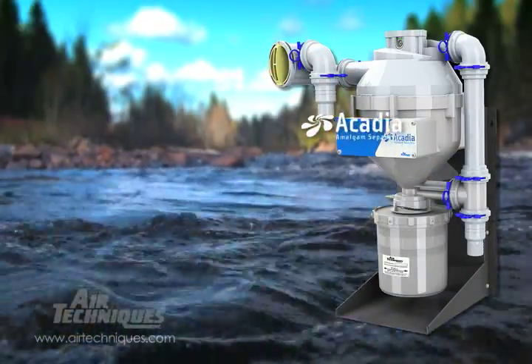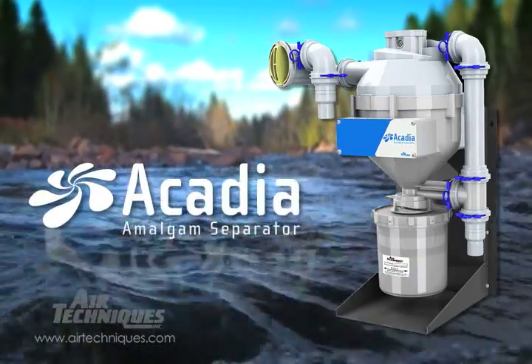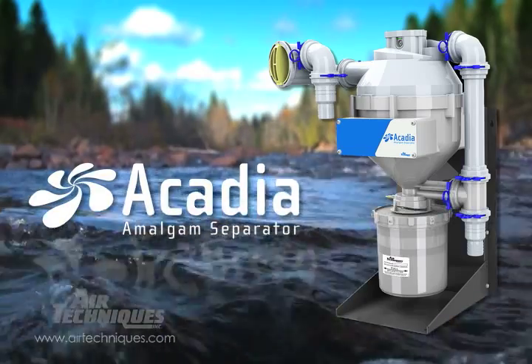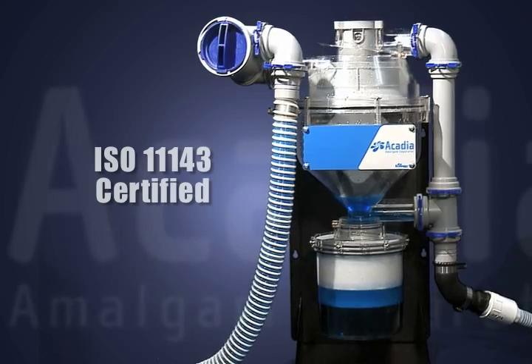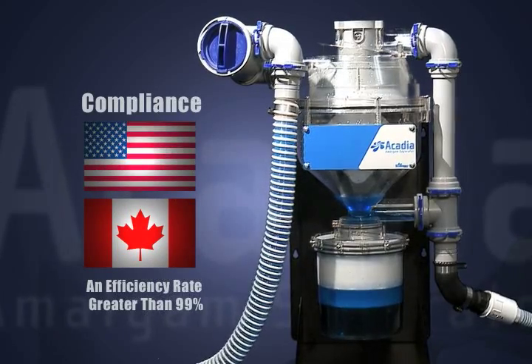Air Techniques has been powering dental practices for nearly five decades. We understand how to create an amalgam separator that works in line with your evacuation system. The Acadia Amalgam Separator is ISO 11143 certified, ensuring compliance with all U.S. and Canadian regulations.